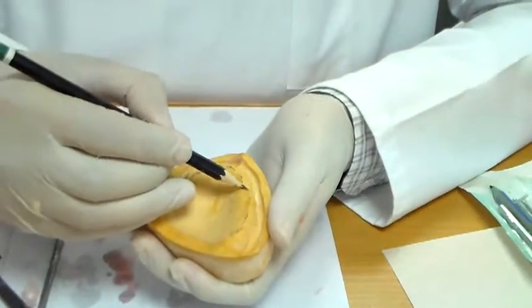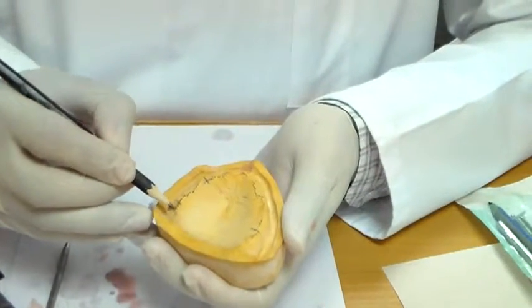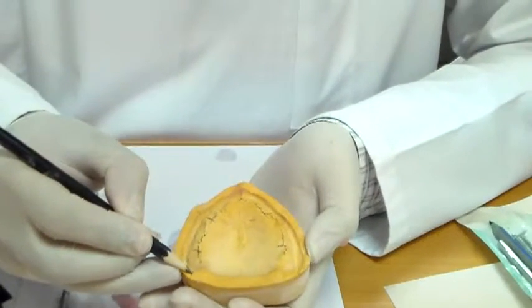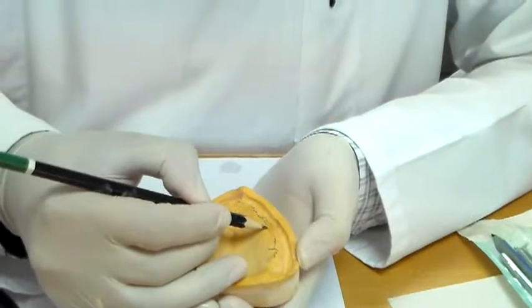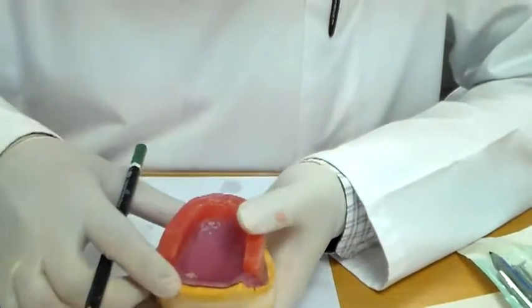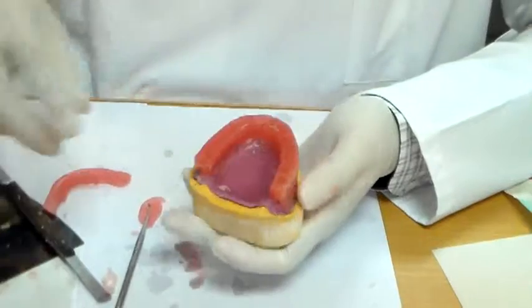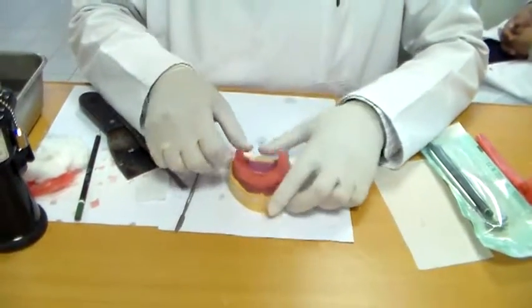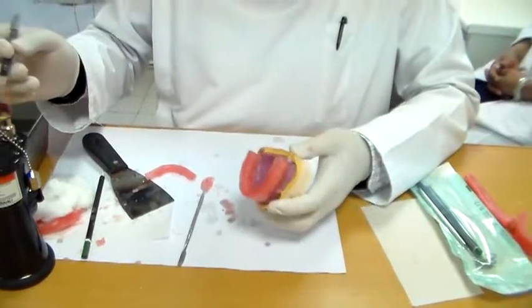Select the part that is the most straight. Just extend it out. This one, I'm gonna go with this like that. I'm gonna go out here. You place your rim. You can see that it's coming up here. It's coming up here. So that's going to be your posterior extent. Seal up the back as well.